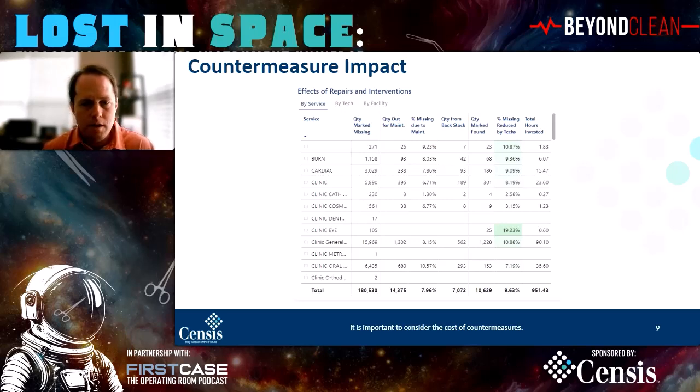And then the second thing is being able to show that cost savings because of the technician's efforts and the cost of those efforts to the facility helps to have that data-driven conversation with the OR. And especially if you can do it in a targeted way. It's this tray that's a problem, or it's this service line, or this OR room where the problem originates. So going back and showing how that interacts with the different OR rooms, super, super helpful.